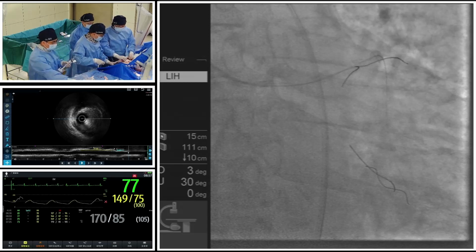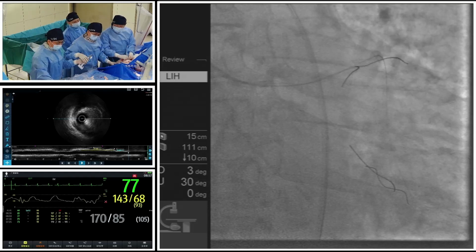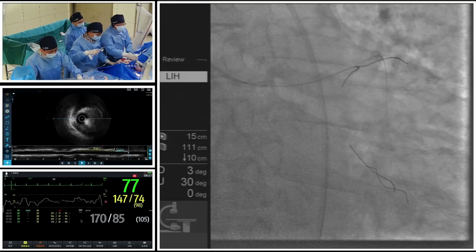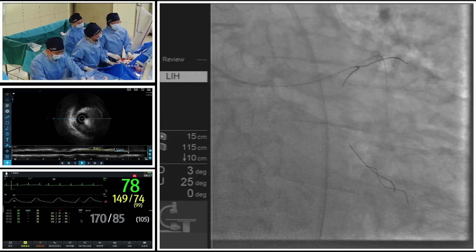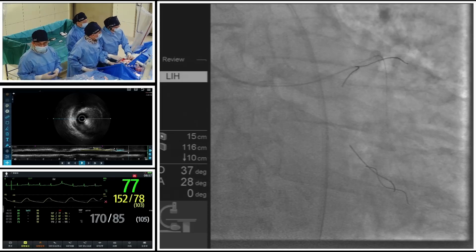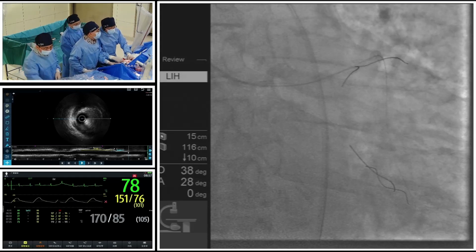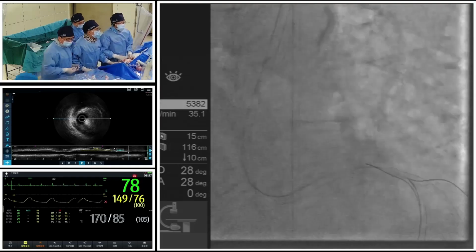It's not necessary to use a bigger burr to cause more risk. And there is one thing I think is worth mentioning. The incidence of side branch compromise, for example, occlusion or slow flow during bifurcation provisional stenting, is of great importance in bifurcation PCIs.